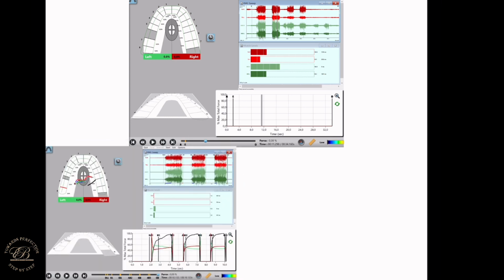Now, instead of showing all the case material before and then afterwards the after pictures, I combined everything so you will be able to see what the result is. So this is his bite when we just take one of the 3 bites out and put them all together in a straight line. You will see that his bite starts up at the right side and actually finishes down at the left side.